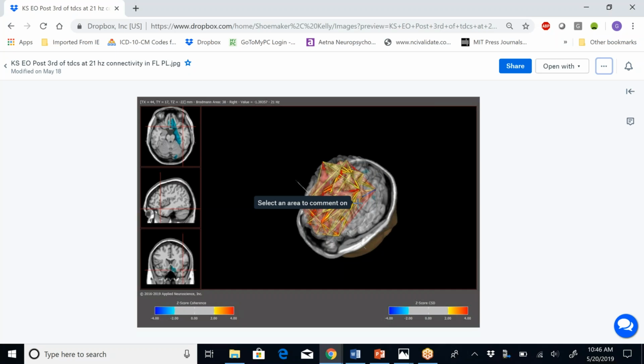Now what will happen with this particular patient, she's currently being retested functionally to see what the functional gains are. She'll go through her washout, and then we'll try a different form of neuromodulation and see if it's better than the results from this. And the treatments, like I said, are typically well tolerated, and not a lot of preparation is needed. They basically come in, it takes about 30-40 minutes, and it's pretty easy to administer.